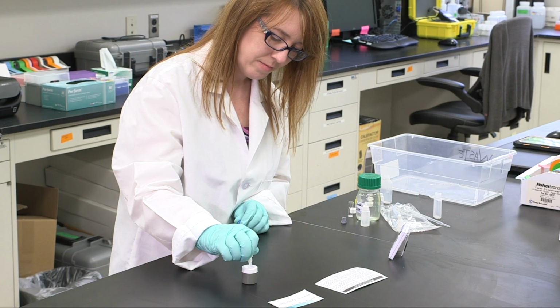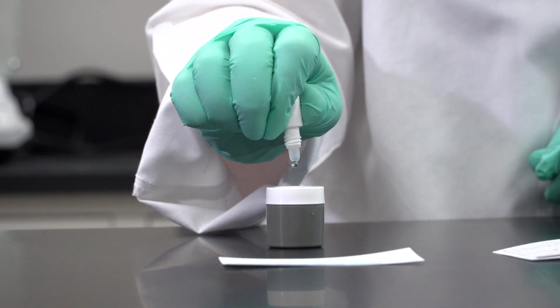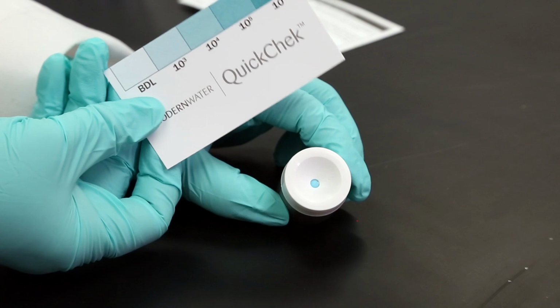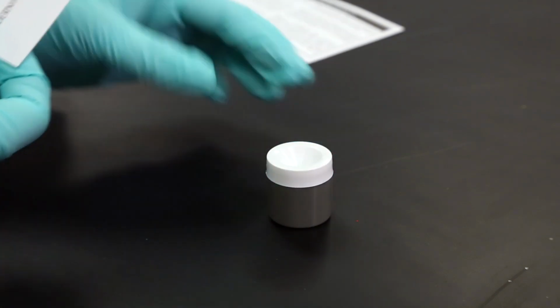Squeeze 10 drops of stop solution onto the membrane to stop the color development. Refrigerate if long-term storage of development is needed. Match the membrane color to the color card provided in the kit to reveal results.